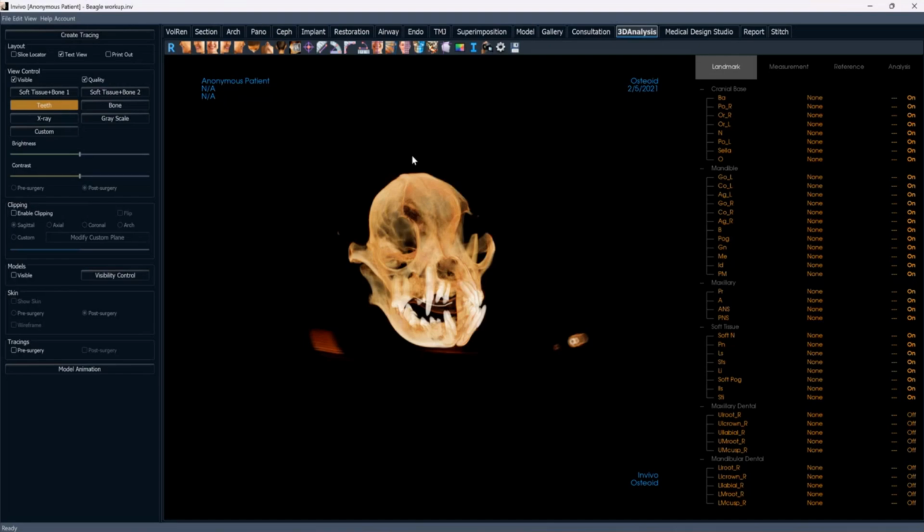With the latest version of Invivo Desktop, my system crashed and I had to be manually backed off to the previous version. Is this usually an indication I will not be able to install future desktop versions? No, absolutely not. That is actually an issue that we've identified with one of our latest releases, actually the one that I'm on, and we should have a patch update to fix that issue shortly. But you can continue to install Invivo, and if you'd like, you can install it on 7.2.2, which I imagine is what you have installed. There's no issue there.